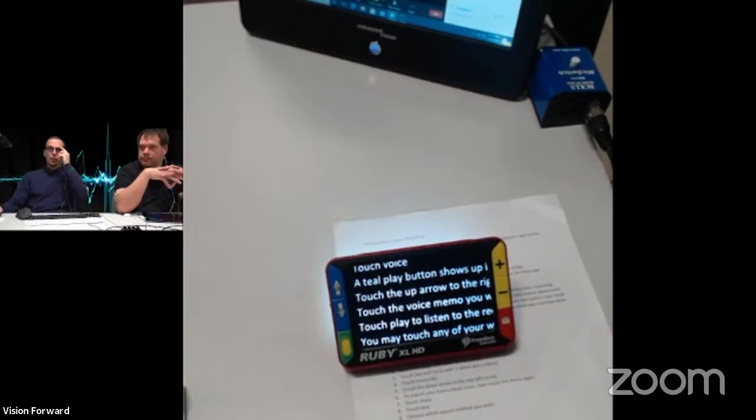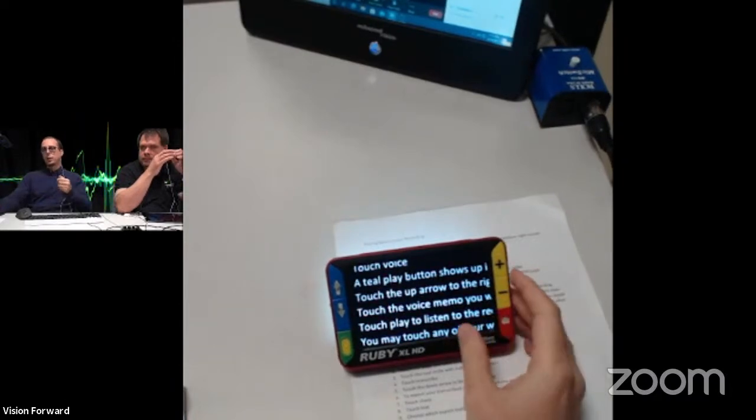And because we don't fit many words on the screen, if you want to sit down and do large reading tasks like reading a book or something like that, this probably isn't going to be the most efficient device for that particular purpose. So that's something worth bearing in mind. But these are definitely used very commonly by our clients, and bearing in mind, we don't generally work with school-age clients so much, but the reason that people like these is you can take them out with you.